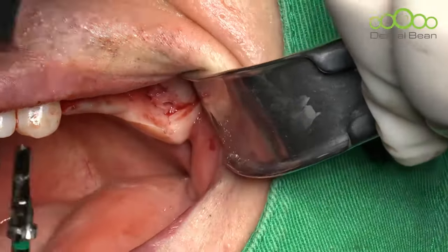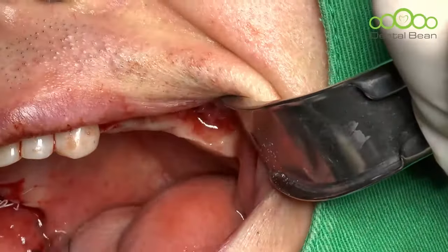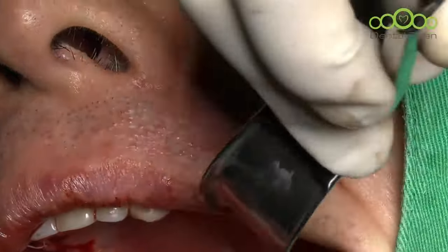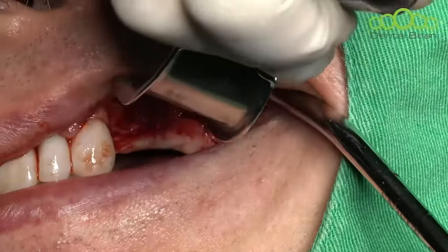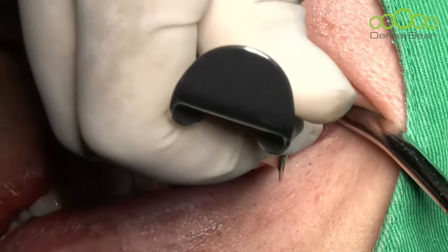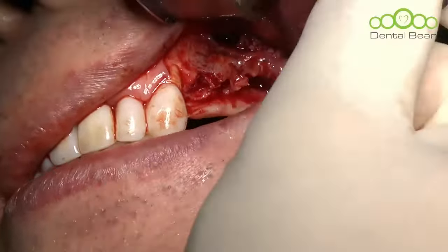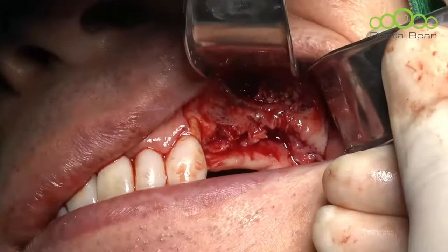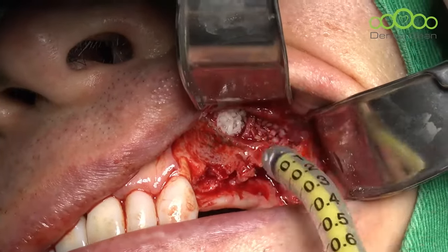Turn to the right side. Too soft. Bone graft. Let's graft material. Where is the mount? Long mount here. Please give me the graft material. Enough. I'll hold it like this. Hold on. Okay, then let's graft here and there.